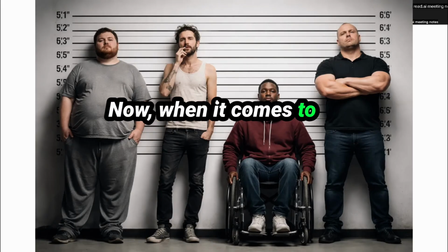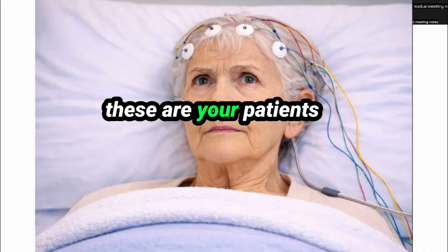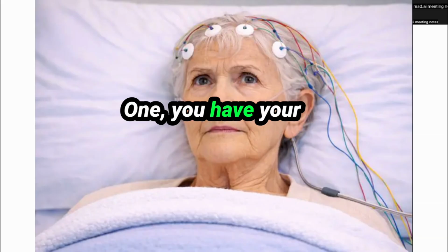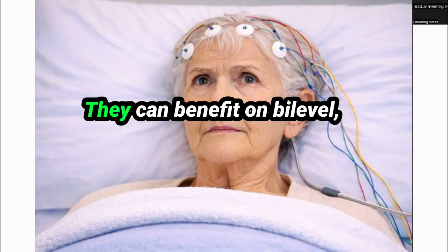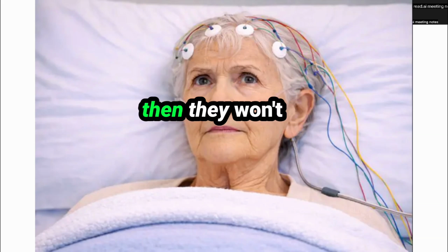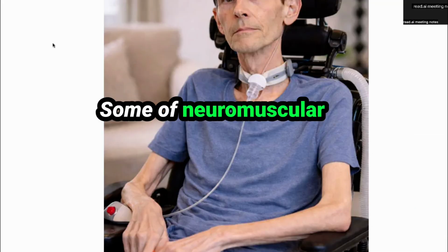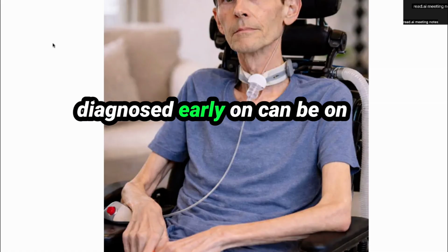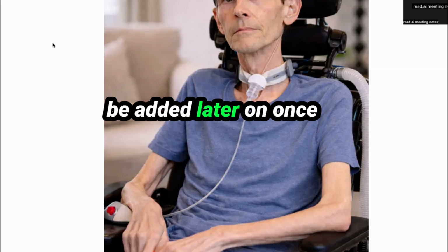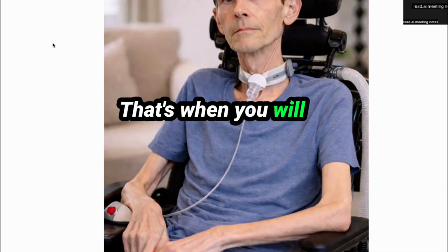Now, when it comes to patients that require bilevel titrations that cannot be on CPAP, these are your patients with hypoventilation or lower airway obstruction. One, you have your COPD patients, they can benefit from bilevel. If they're at the beginning of their disease, then they won't need a backup rate. They could be okay with bilevel alone. Some of your neuromuscular disease patients that are diagnosed early on can be on bilevel without a backup rate. So the backup rate can be added later on once the patients start to exhibit central apneas. Okay, that's when you will need a backup rate.